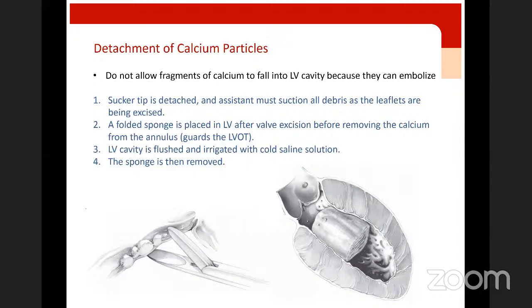Here, care must be taken not to allow calcium particles to fall into the LV cavity, as this can result in systemic embolization and stroke after surgery. Normally, the surgical assistant would hold a big sucker without the tip and would be suctioning all the debris as the valve is being excised.